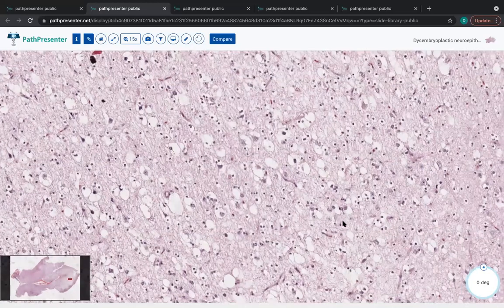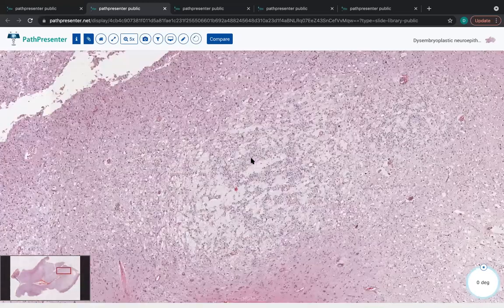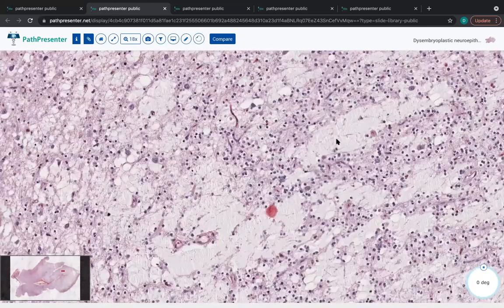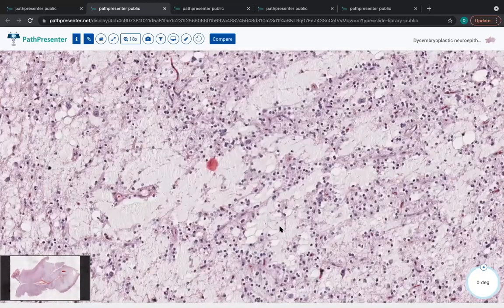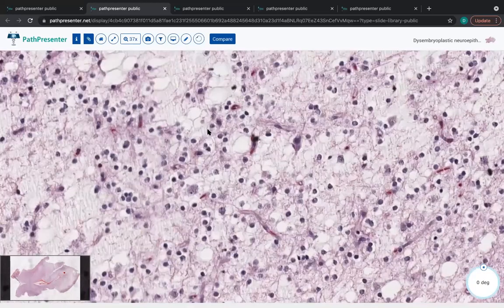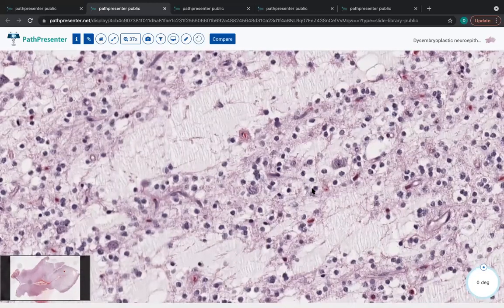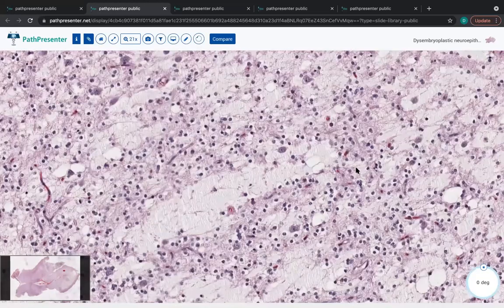And so as a result, the mucinous pools that are frequently associated with this tumor type, here's a good example. You can see this kind of microcystic appearance of the lesion can envelop existing background neurons and produce this highly characteristic so-called floating neuron appearance. In some cases, it looks just like a neuron has jumped into a swimming pool of mucin. Here's a small one, for example. Here's another example. But this is pretty much how these tumors look.